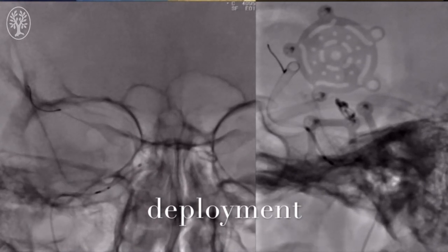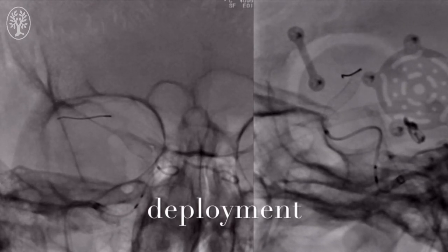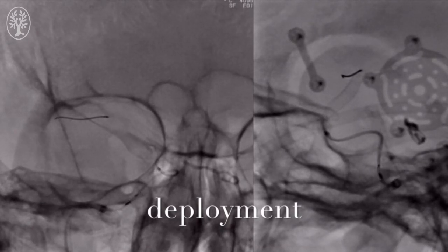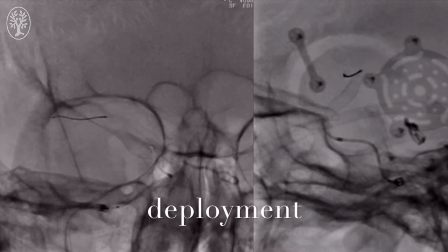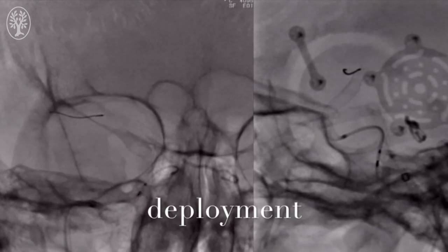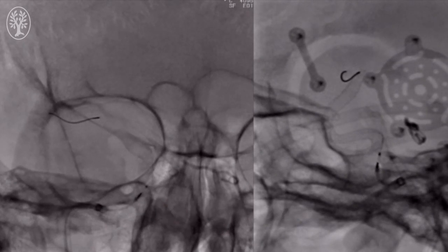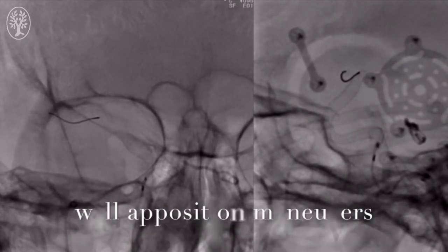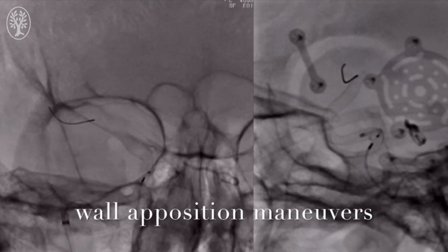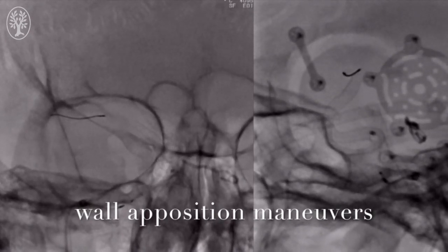Note that the microcatheter has not been fully withdrawn, so this device remains completely retrievable. That last distal part of the device is retrieved, and additional forces are applied in the paraclinoid segment. There you can see the device just sprung open in the paraclinoid, and once that is done, the last little bit is simply unsheathed. Then to further compress, you can see the device is being recaptured and additional forces applied to foreshorten the proximal end of the device.